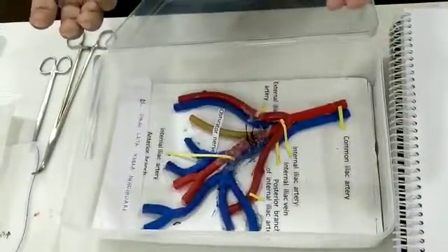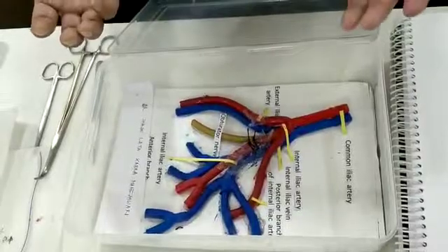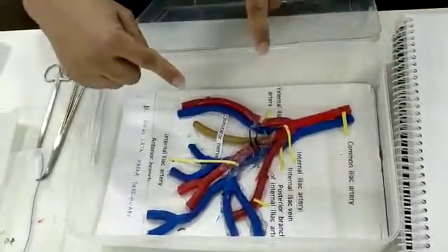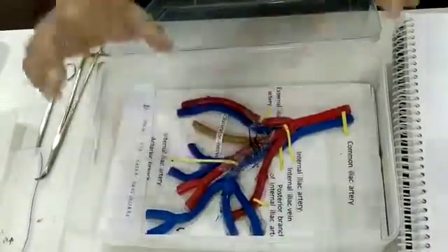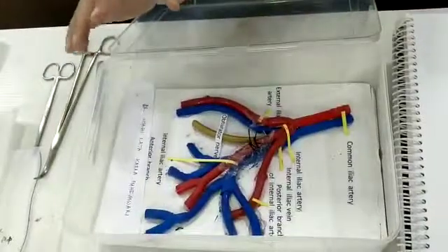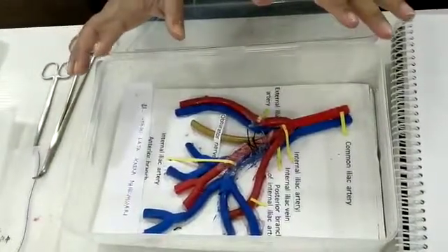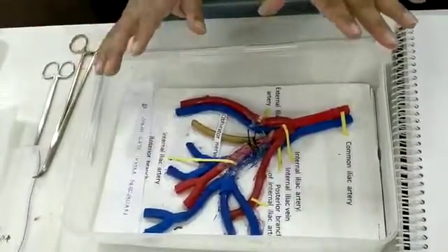This can exsanguinate the patient immediately. So when we apply the suture, with the help of the fingers we tie them and apply them on the top of the artery.